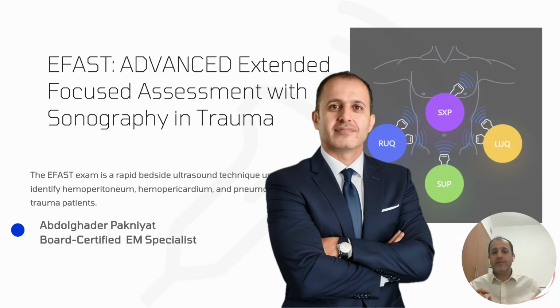For example, if you want to have a look at the kidney, the depth should be higher, more like 15 centimeters, since it's deep, it's retroperitoneal. But if you want to check something superficial in the skin, like a superficial abscess, we don't need that much depth. Maybe 2-3 centimeters, 5 centimeters is enough. So based on the study, we should adjust the depth.